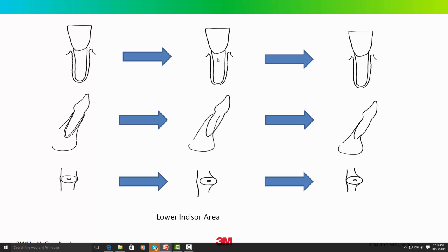Now, that would not be something that you could see from the coronal view. But from the sagittal view, the tooth goes through the boundary, and then you get an adaptive resorption of the bone on the lingual surface of that incisor. There's a tooth-dependent bone morphology that seems to occur, especially in the lower arch.